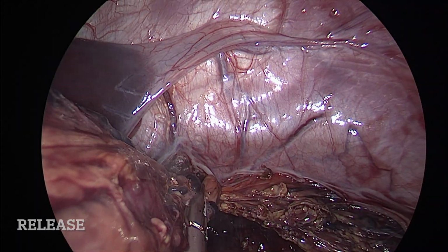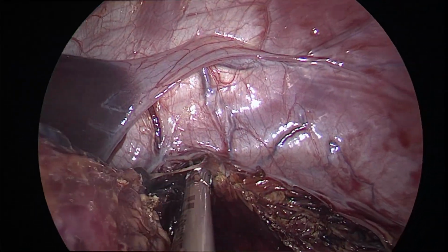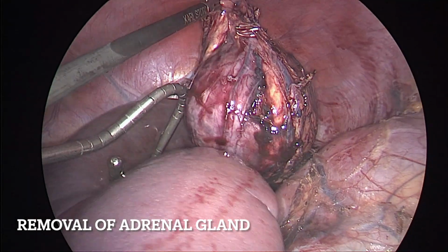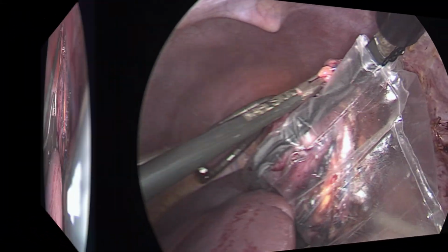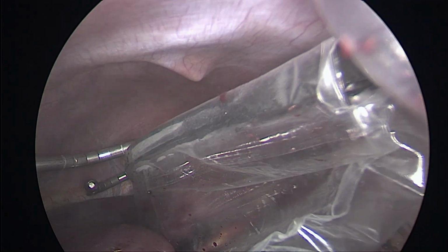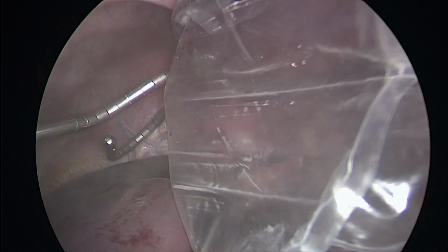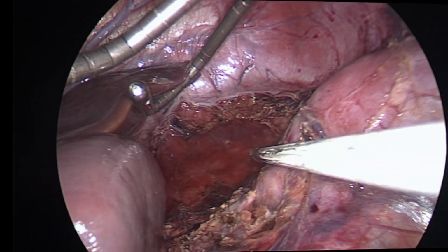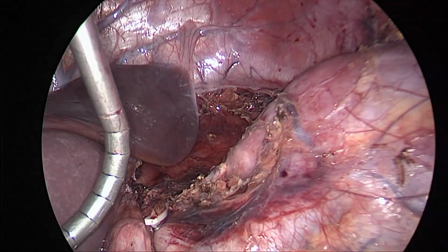Total release of the gland was achieved. After confirming lack of bleeding, the surgery was completed.